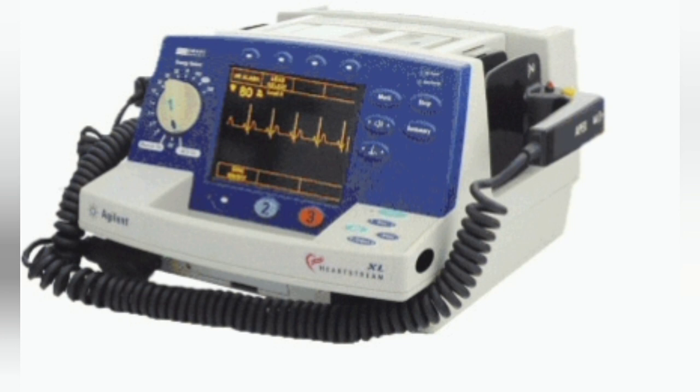The capacitance of that capacitor is very important in deciding the value and worth of the defibrillator. Based on these design aspects, the types of defibrillators vary, and the capacitance of the defibrillator also varies from external to internal defibrillator.